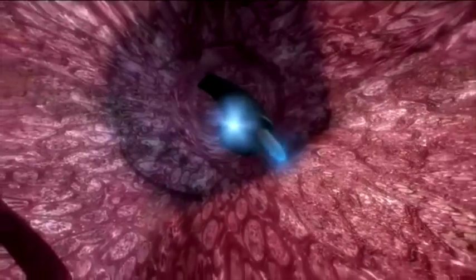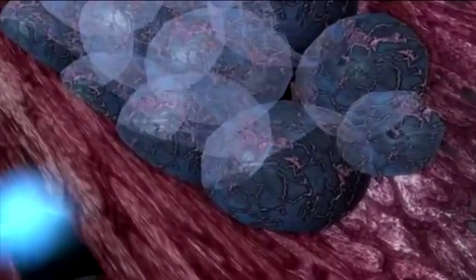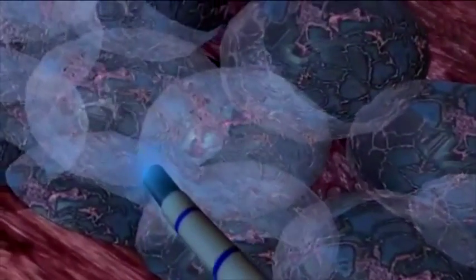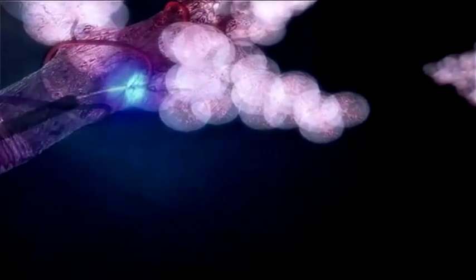The laser beam travels through the fibers of the confocal mini probe until it reaches the area to be examined within the patient's body. The laser scans a 600 micron area of living tissue, and the resulting lateral resolution is 3.5 microns.